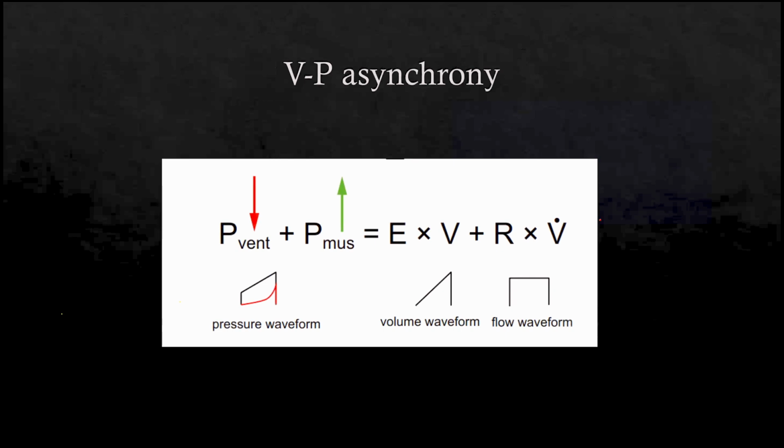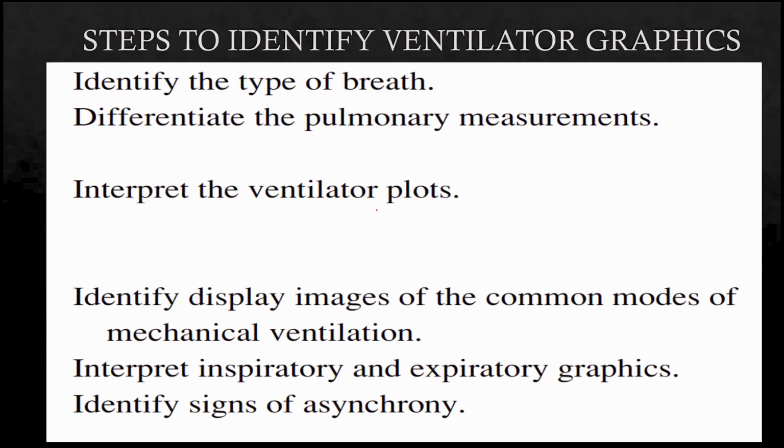Now, when the patient's muscle activity comes in, that is when the picture becomes even more complex, and the situation changes from control to assist control, and lays the bedrock for the possibility of ventilator patient asynchrony if the patient is not breathing in tandem with the ventilator.